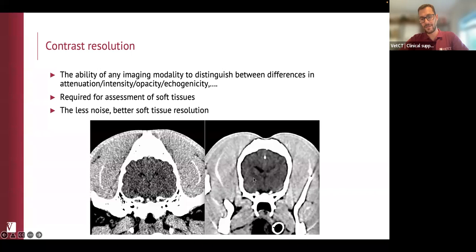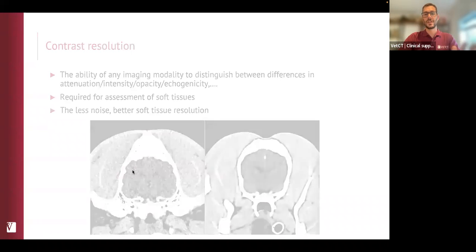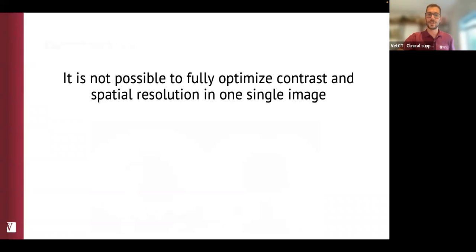But there are things like, for example, the white matter. You see that darker area inside the brain, you can see it radiating. So that's the corona radiata, that is the white matter of the brain. And if the image is sufficiently good, we can see that in a pre-contrast series. Well, here we are missing that, okay? So that's what contrast resolution refers to.